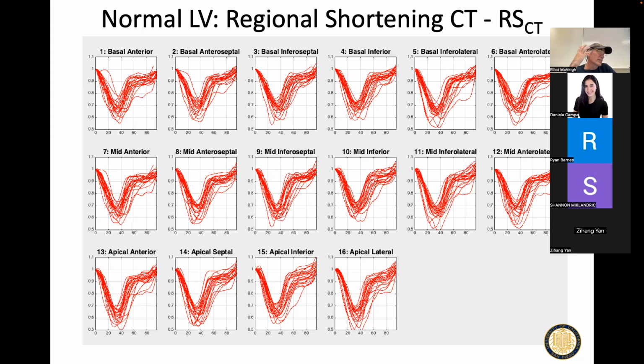People don't think in areas, right? If you say, well, what's the area of this room? Nobody can tell you, unless they're a real estate agent, they can't tell you the area of the room, but people think in linear distances easily. So you say, how long is this room? You go, oh man, it's like 12 meters, boom, and you're done, right? Whereas in strain, whenever you report a myocardial strain, it's usually reported as a one-dimensional strain. Oftentimes, it's reported as a one-dimensional strain in a particular direction.